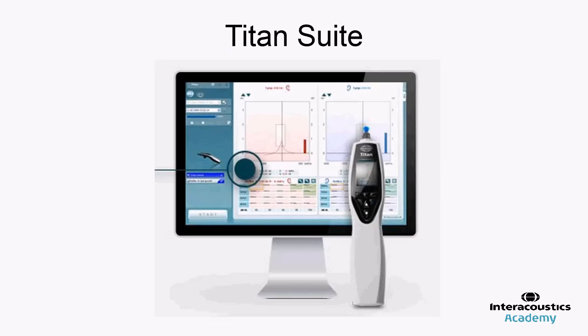So the Titan suite includes a handheld device. If you're using a handheld device, you can't actually save or make the measurements with wideband tympanometry, so it requires the whole suite where you would use the software in addition to just the handheld device.